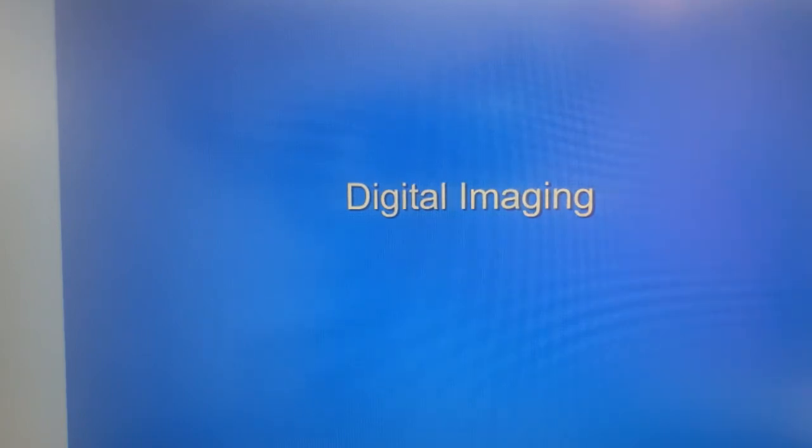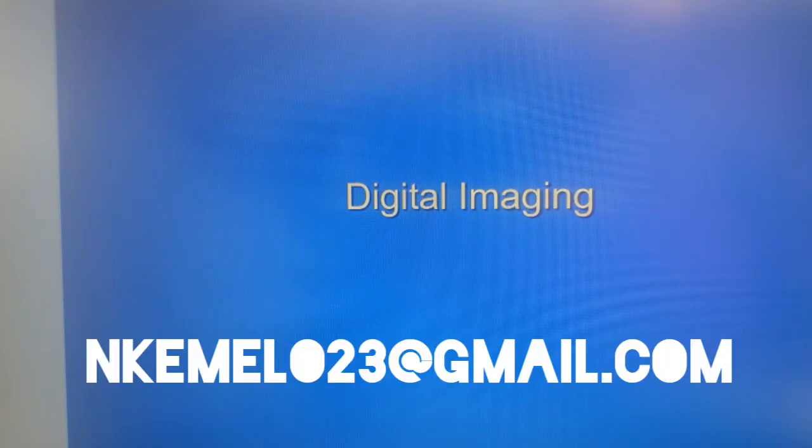So some of these enhancements will include correcting or adjusting for density and contrast, digital subtraction, embossing the picture, magnifying the picture if necessary, making use of measuring tools such as with endodontic treatments if that is necessary for a patient, reversing the grayscale so that we can actually try and get a good diagnosis of a particular tooth or teeth, as well as then making use of side-by-side displays of images. So those are some of the things that we may be able to do or manipulate with direct imaging systems, as well as their associated computer systems. So those are some of the things that you'll be practicing and encounter in private practice.